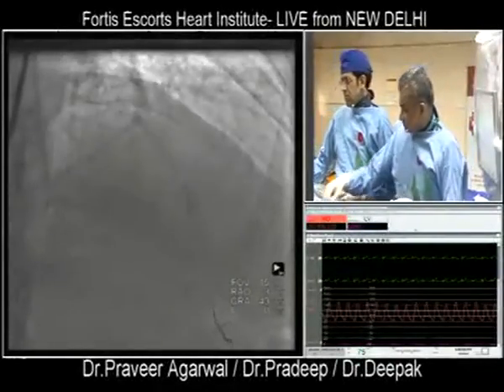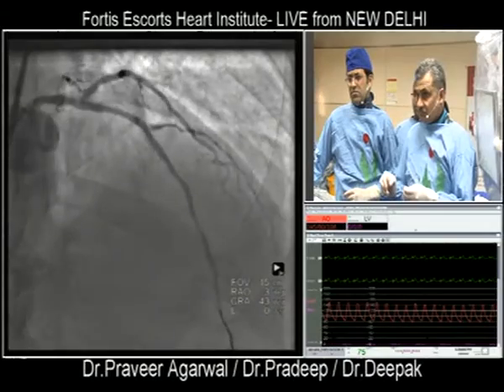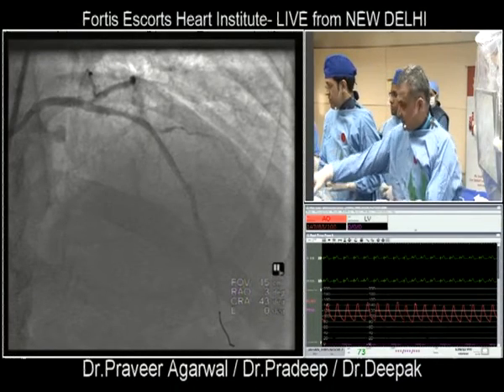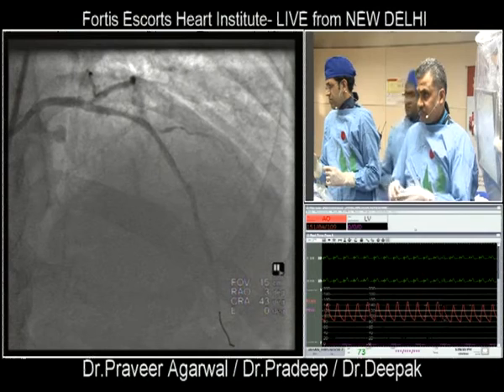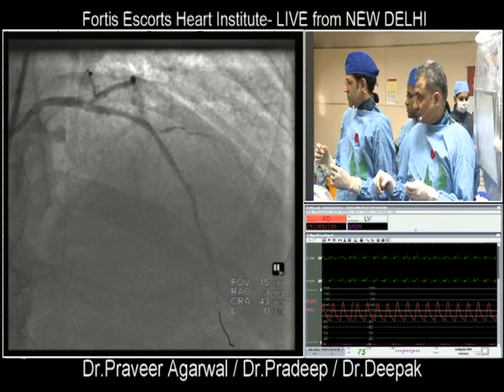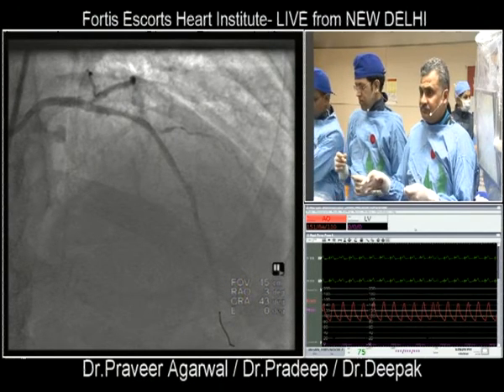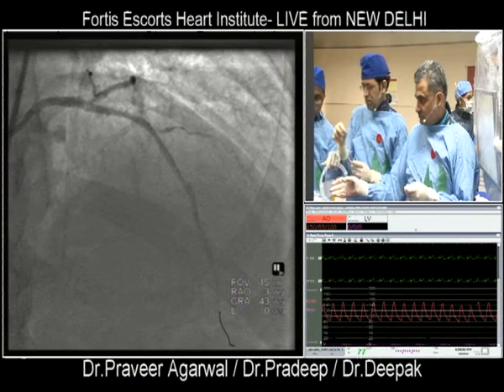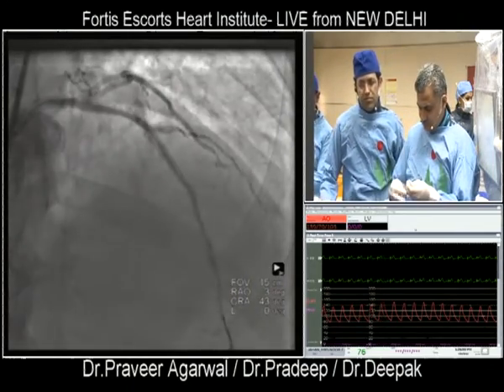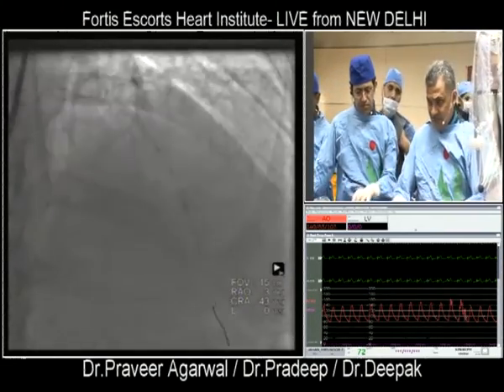You fast. 15. Did you? 15. Quick. So we are just going with the 3.0 high pressure balloon.